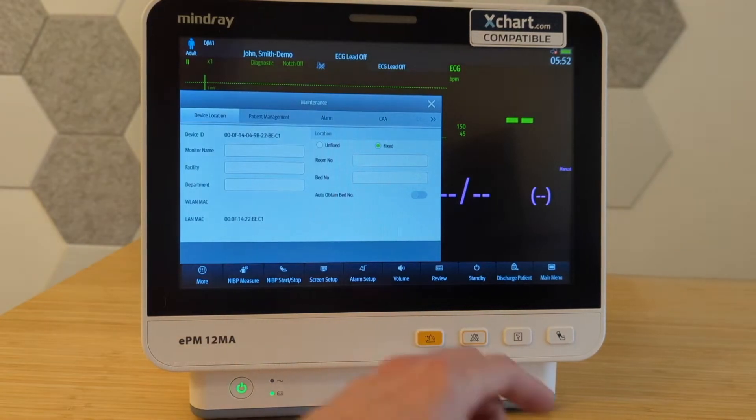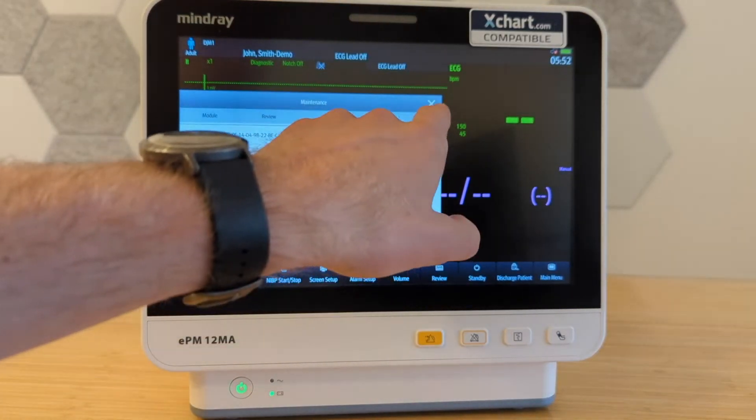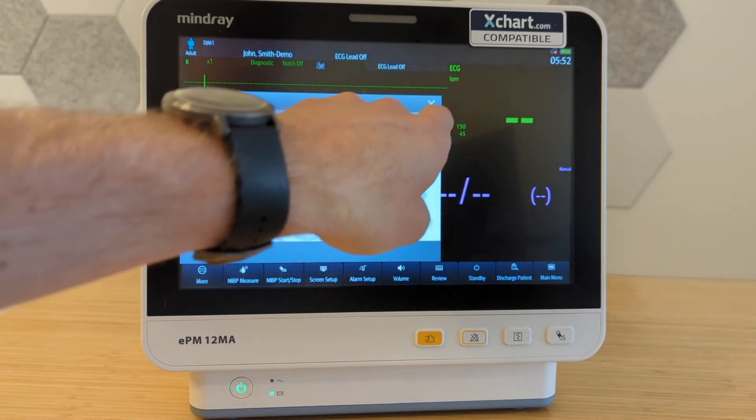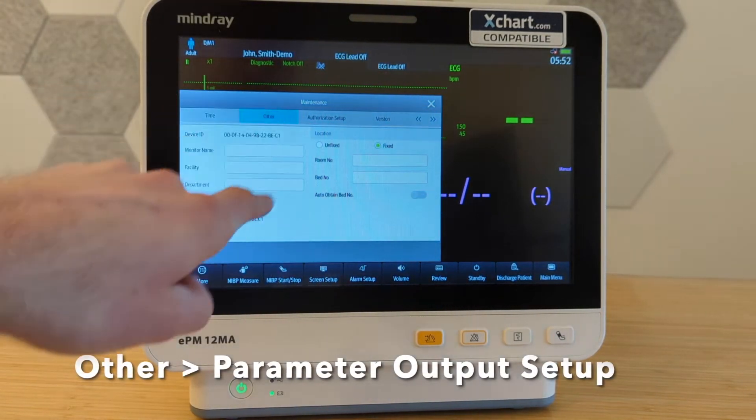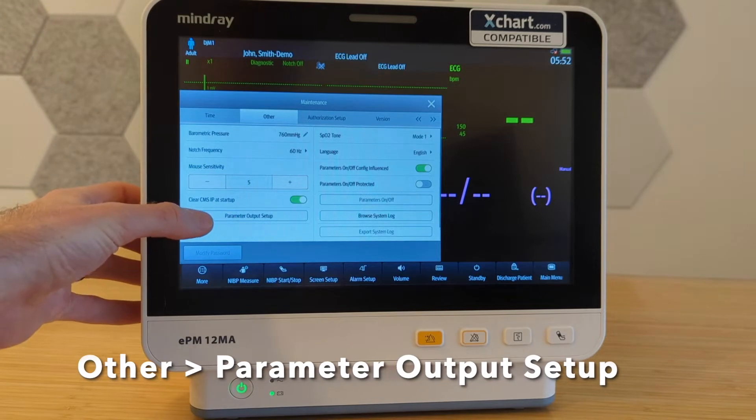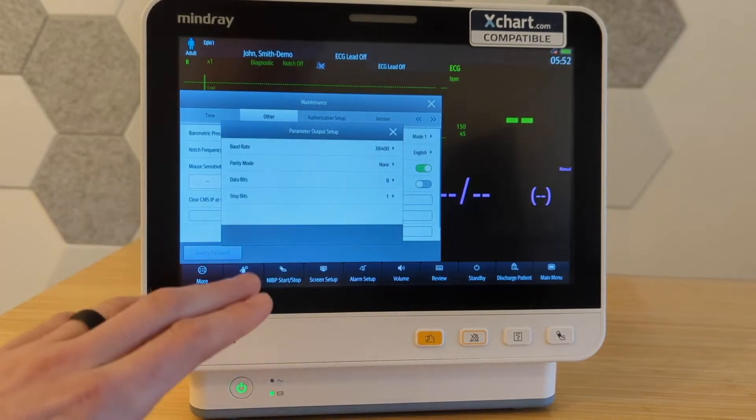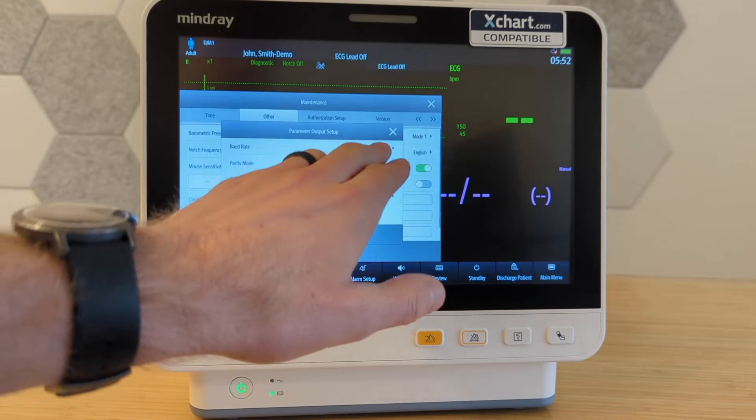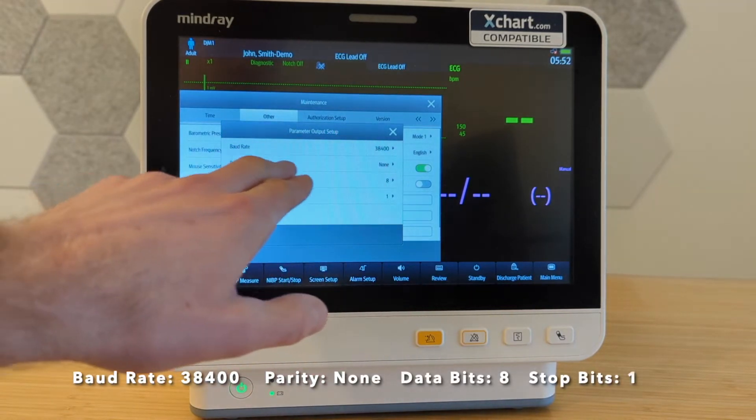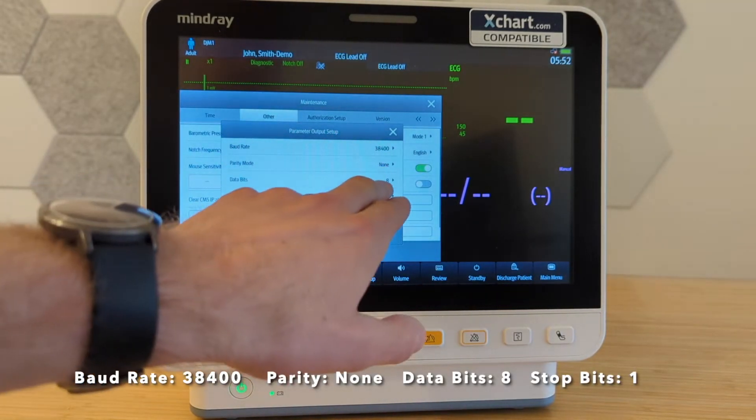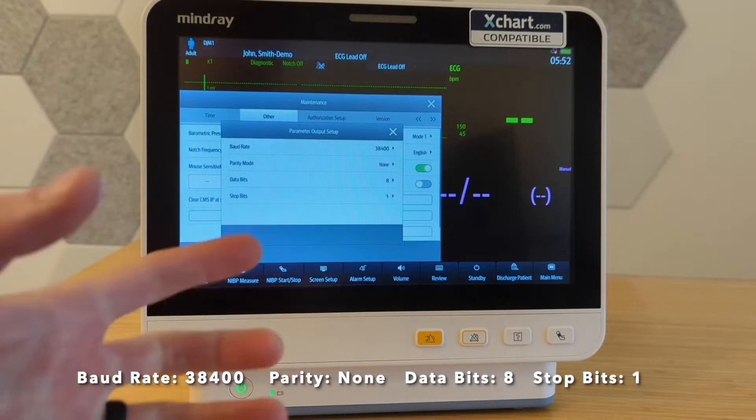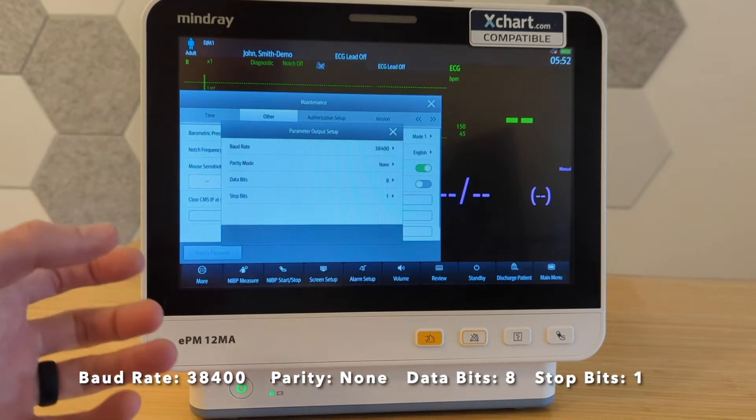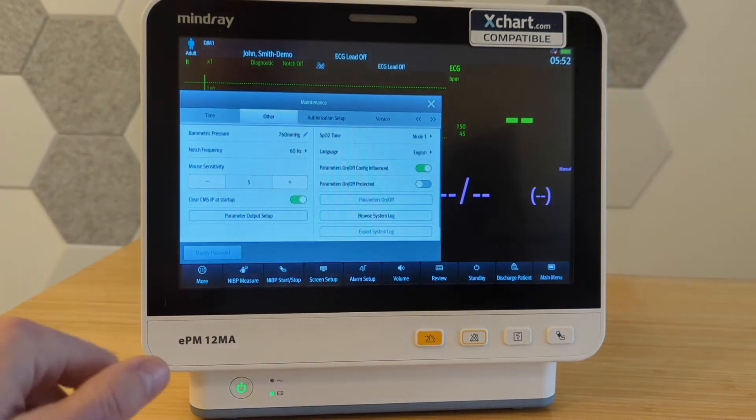And now there's two settings we're going to change here. If you use these little arrows, you can navigate across the top and we're going to go to the other tab first. And then here in parameter output setup, I'm going to tap that. Make sure that it matches what you're seeing here on the screen. So it's going to be 38400, parity mode is none, data bits is eight, stop bits is one. This is talking about the physical connection settings, like in terms of the signals that get sent across that serial cable.